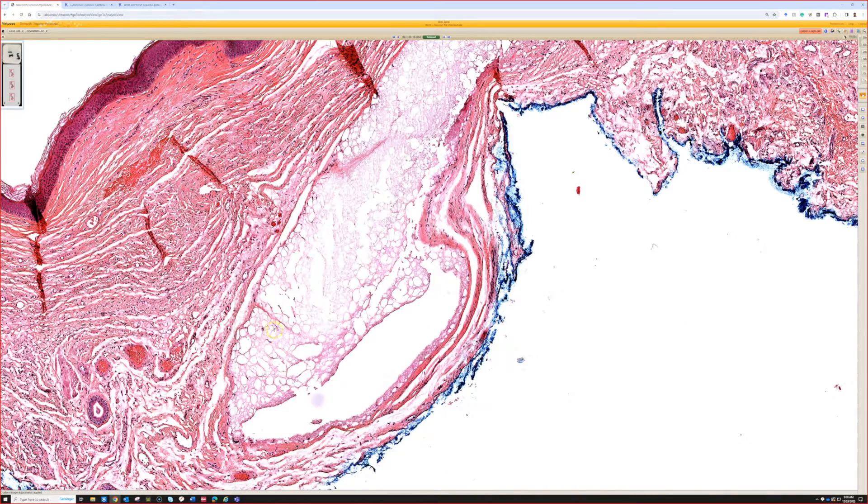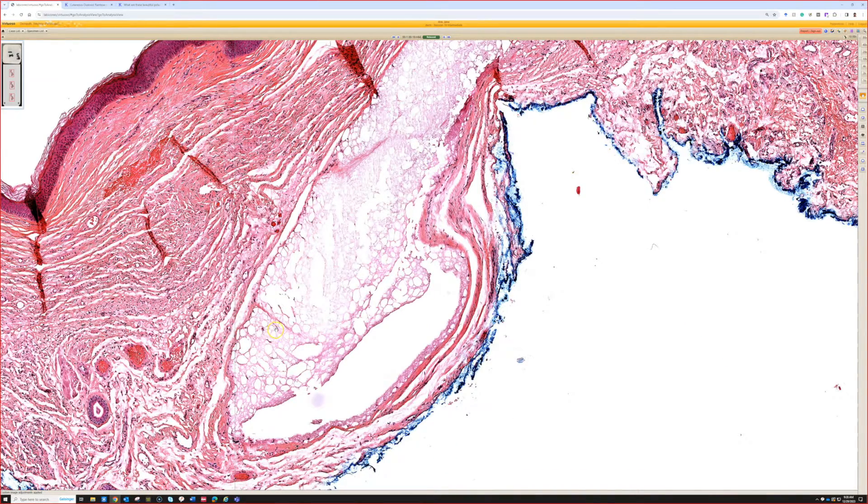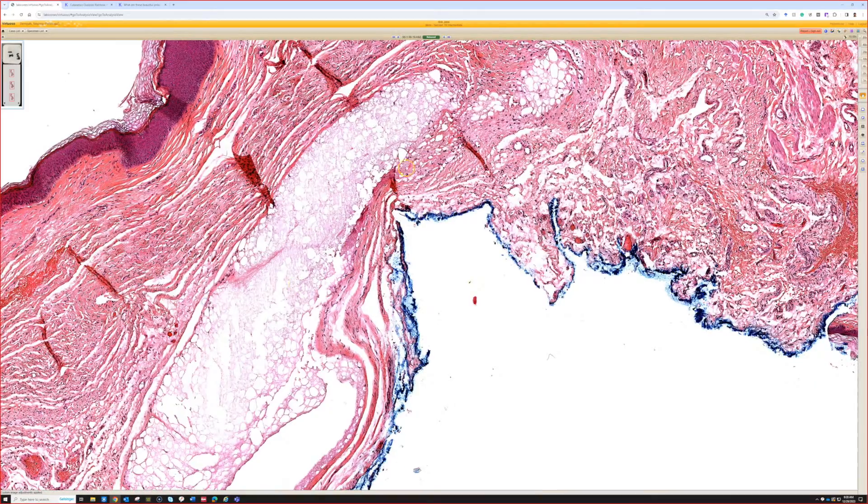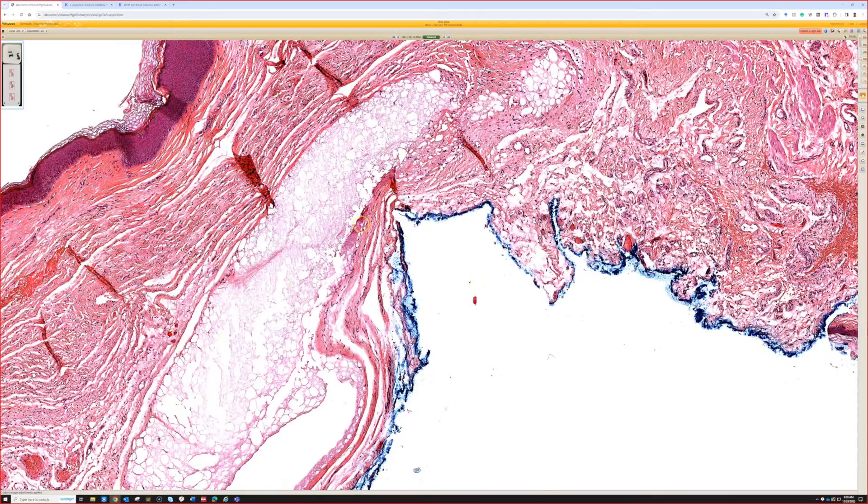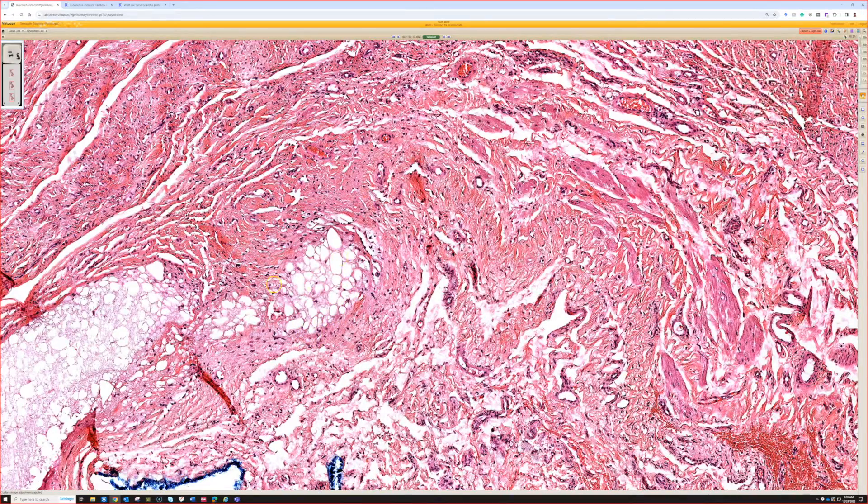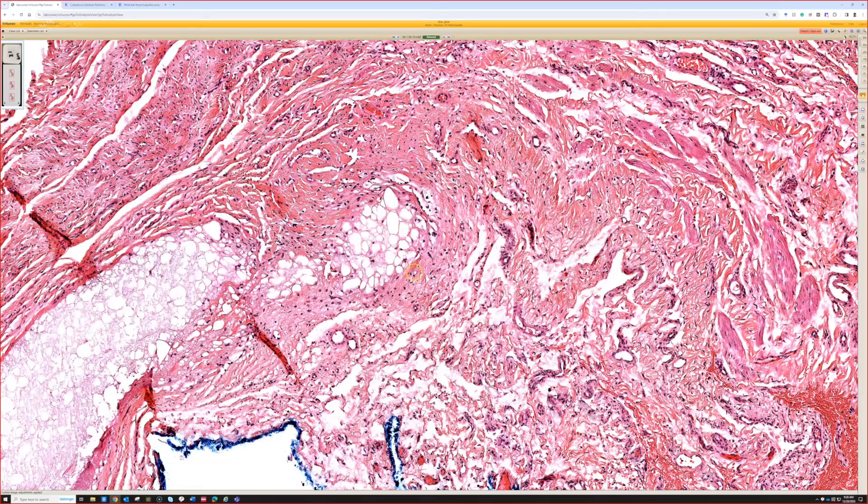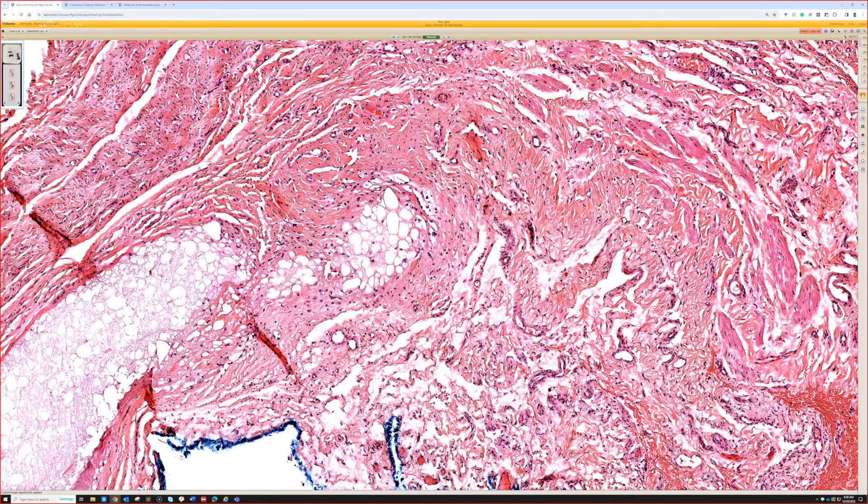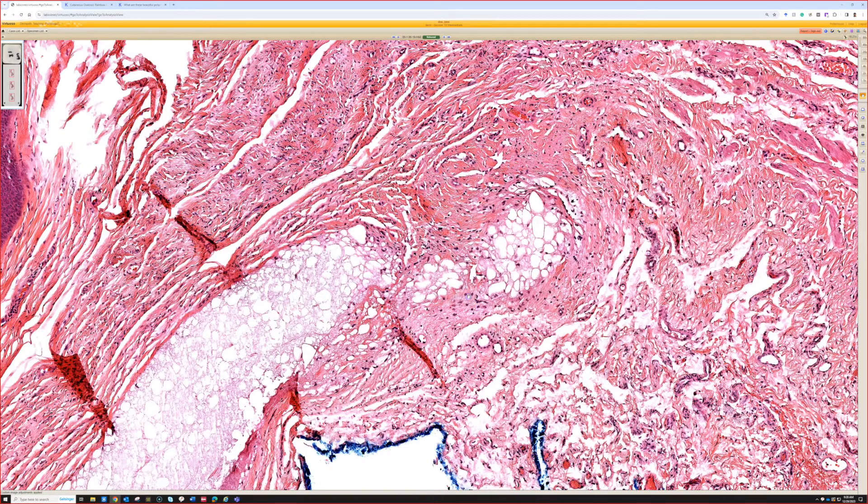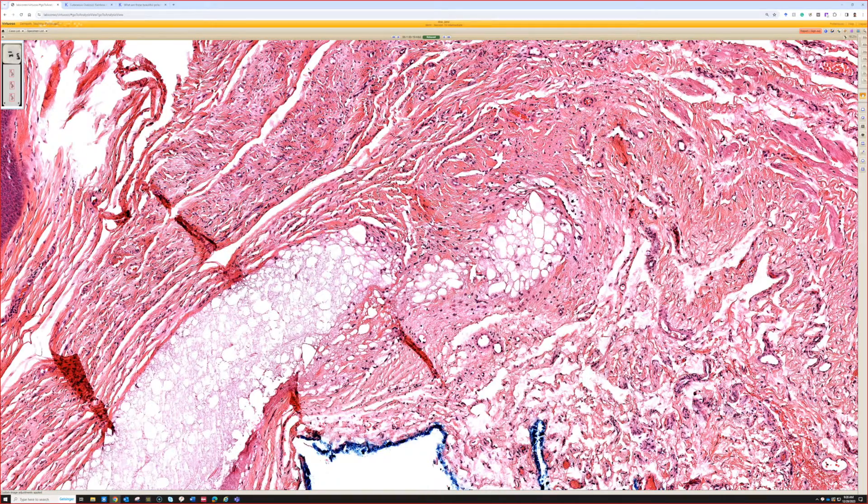And usually you're going to see this because they've injected a scar or a keloid, and then it later gets surgically removed. And it can persist as little pockets here in the middle of the dermis for quite some time after the injection. I've seen cases where the injection was many months previously, and they still had some of it there.